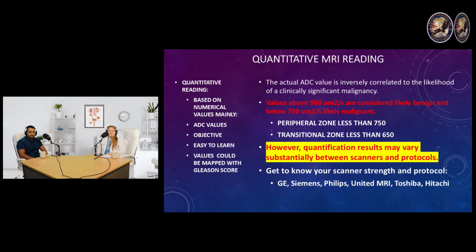Okay, so for quantitative reading, it's very different. I feel like PI-RADS is challenging depending on, again, before coffee or after coffee and how you see the grayscale. Right. There are a few caveats on why this has not been taken over instead of PI-RADS, and we'll go over that.